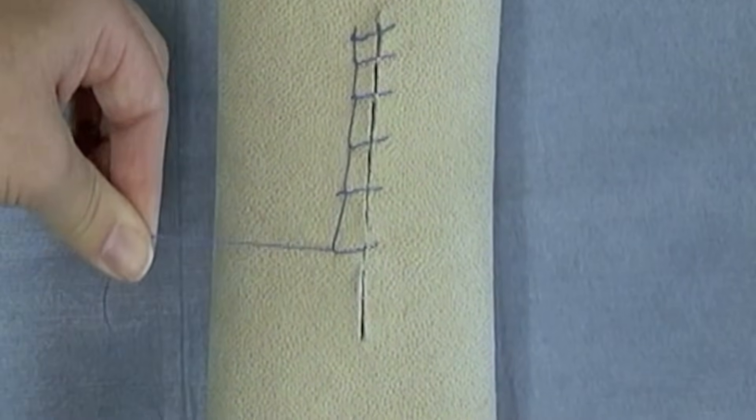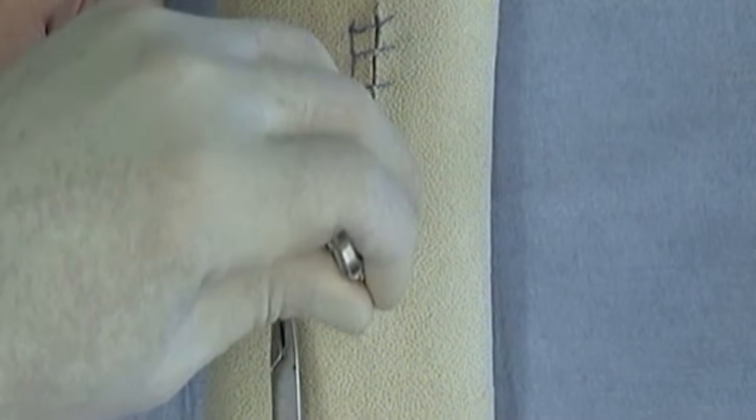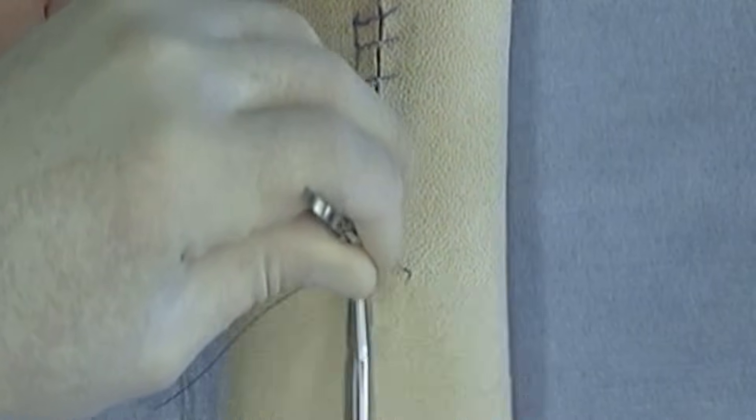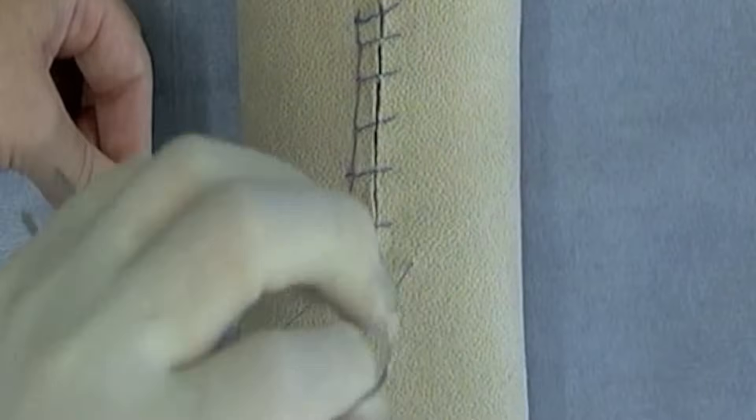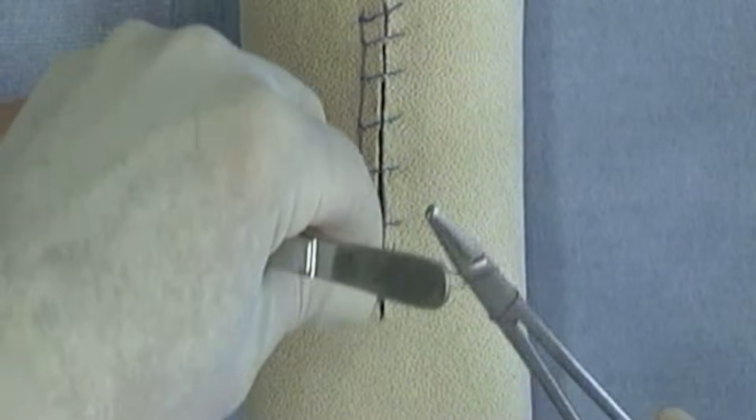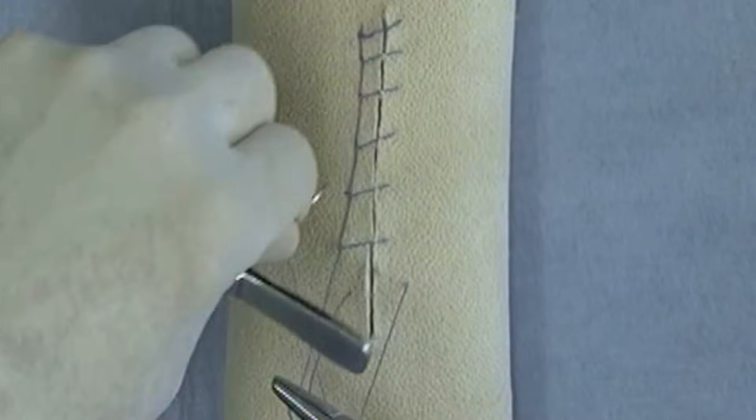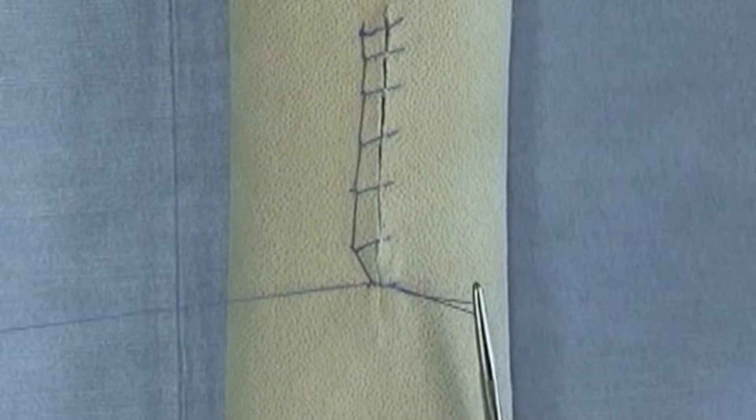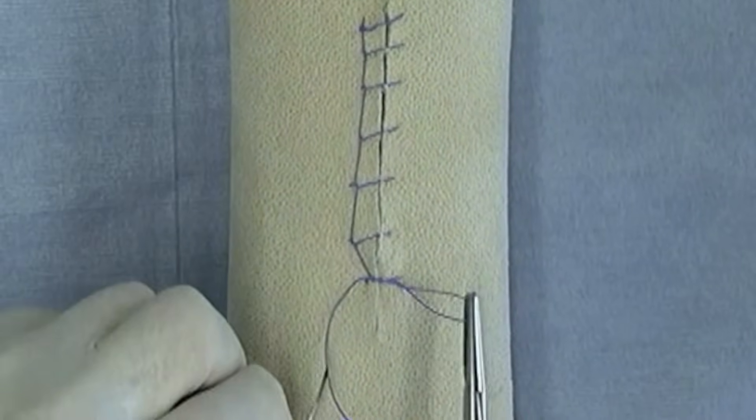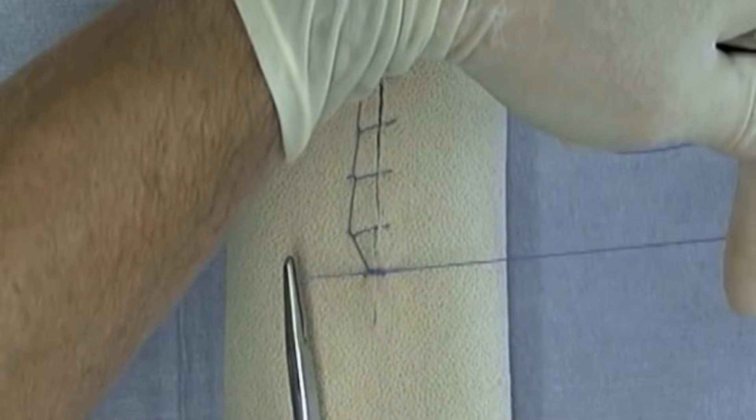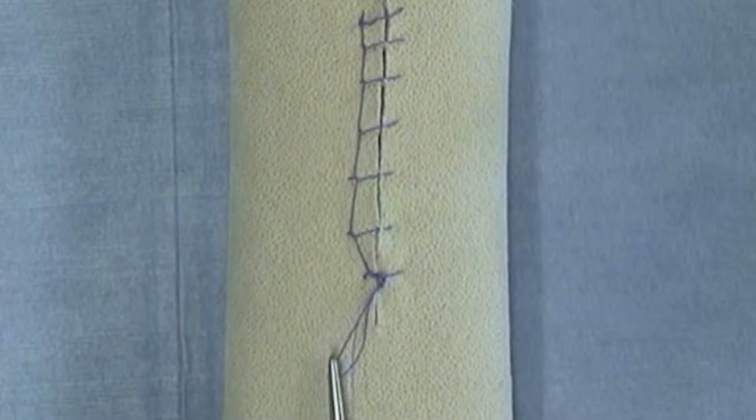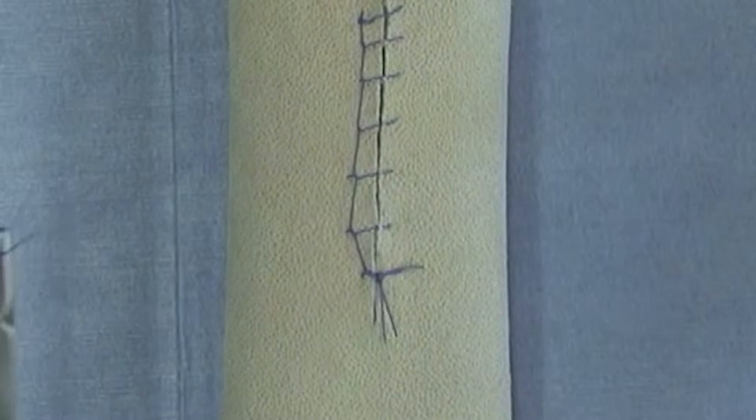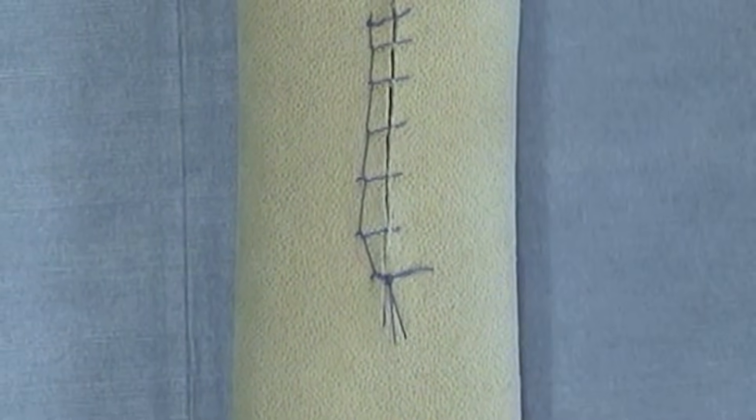And to end this we're going to end it in a backhand suture bite and we're going to tie back to the loop, thus finishing the forward interlocking pattern.